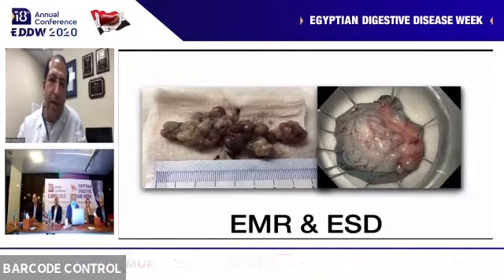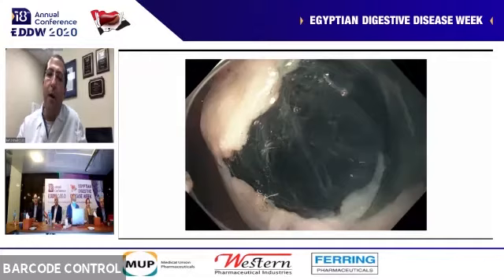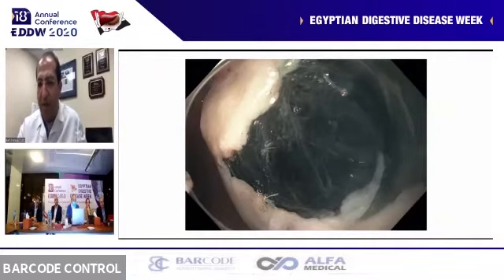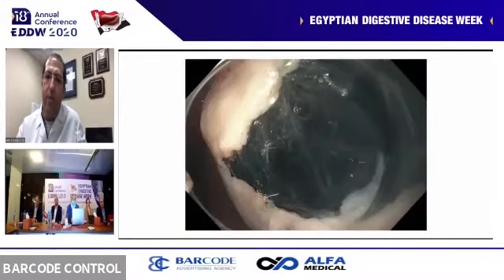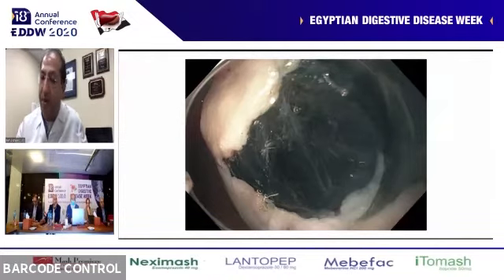And then endoscopists said, can we do better? Can we resect these in one piece? And that's the ESD, endoscopic submucosal dissection. And while people are performing ESD, especially in the Far East and Japan, it came to realization that there's something called this third space, which is basically a space that can be created between the mucosa and either the other side of the mucosa or the mucosa and the muscle. And if I am able to put a tool or an instrument in that third space, expand the third space, use the third space to reach to other organs or other areas, then that's third space endoscopy.